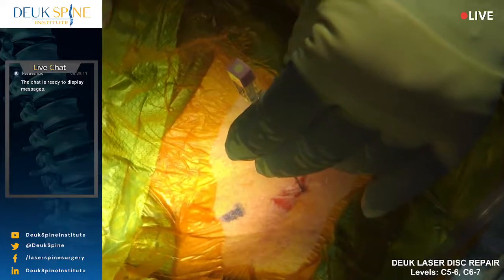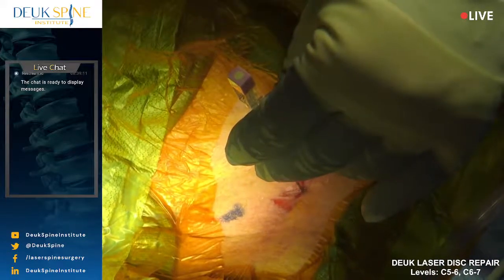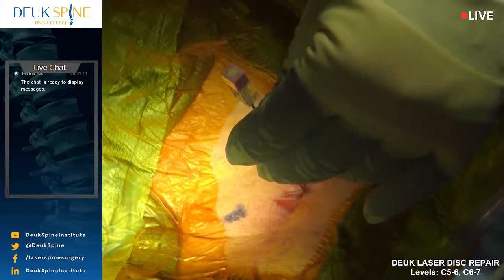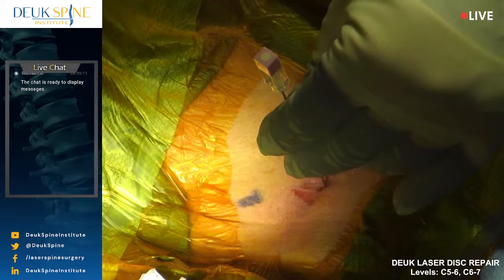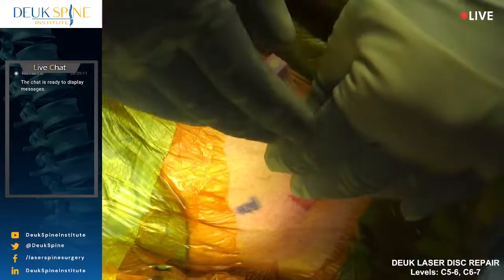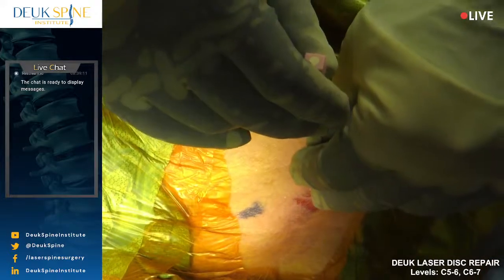All right, we need you to pull. We're going to be repairing 2 disc herniations, one at C5-6, the other at C6-7. That's perfect, guys. Relax. I'm very happy with where we are.